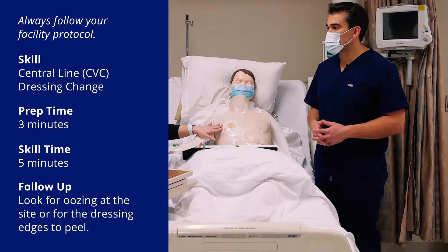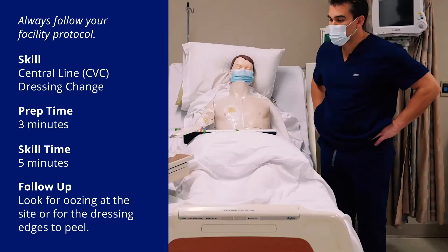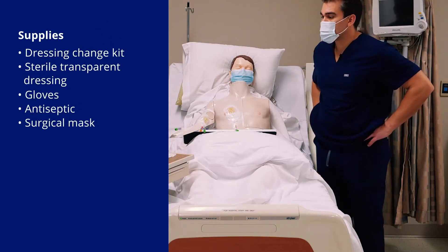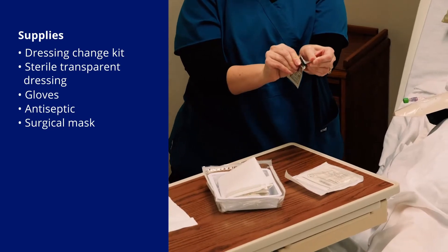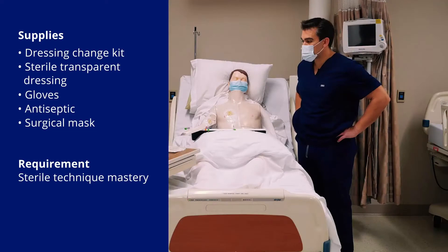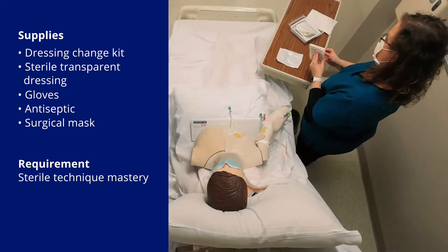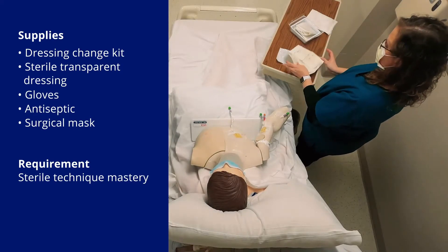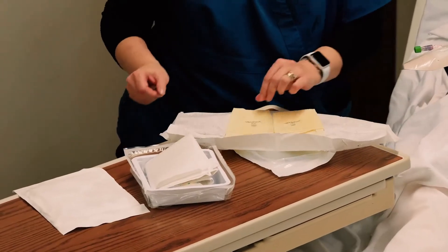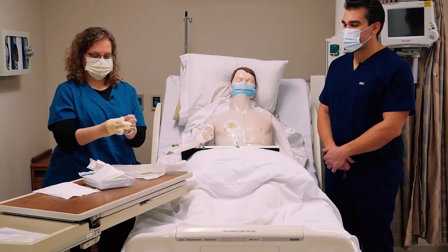Each line also has parameters for how long it can dwell in the patient for infusions. I'm going to open my kit now. The first thing I have is an antiseptic, so I can clean my hands first. Not every kit has that, so you have to have some way to do hand hygiene before you do this. I'm going to put on my sterile gloves — the antiseptic makes your hands really sticky.